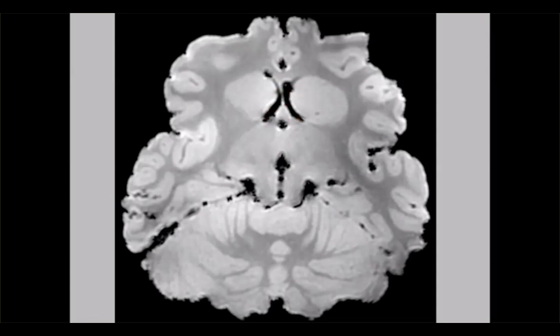Do you notice the ventricles? These are the ventricles. And you can kind of see all those holes, but do you see that they have kind of like a structure, and there's a little bit of brightening next to them. Any ideas? Any ideas what these could be? Like what causes this? Are there arteries, blood vessels? No. What they could be, but that would not result in those type of artifacts.